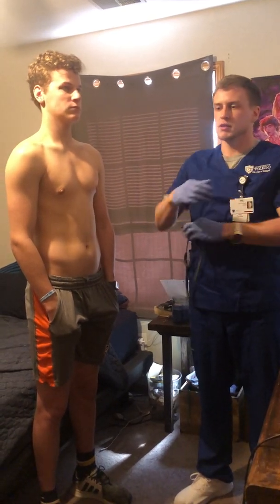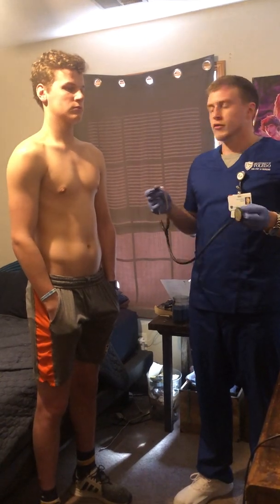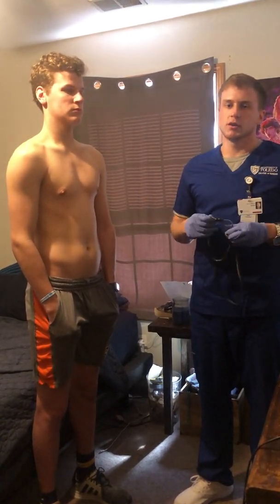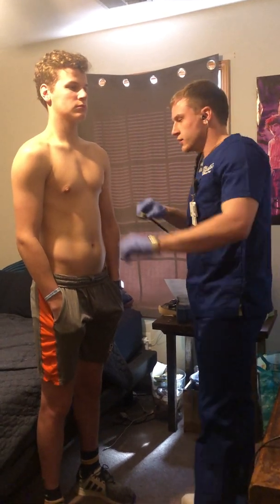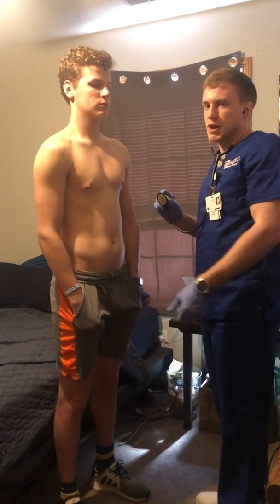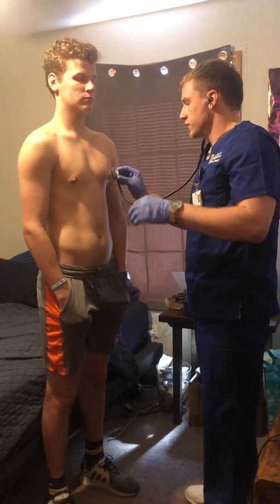So because the rhythm is normal, we can go ahead and take his pulse rate for just 30 seconds. If it was an irregular rate, we'd go for 60, but it's normal, so we're going to take his pulse for 30 seconds. And I'm going to do this at the apex of the heart, which is the mitral sound, because that's where I heard it the loudest.